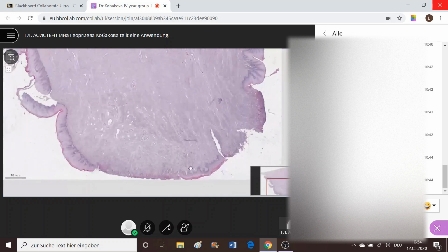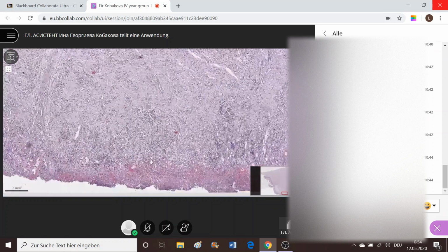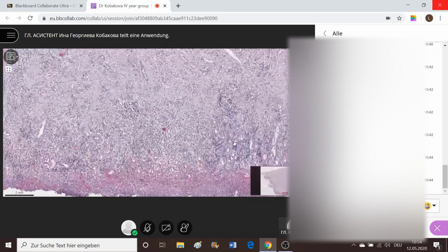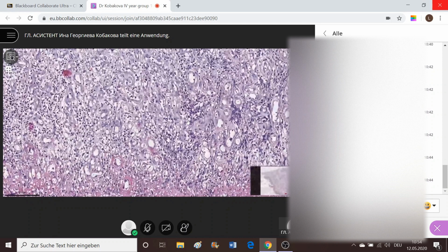And since it's desquamated, missing, and it's proceeding with mixture of necrosis, acute and chronic inflammatory infiltrate, both together in the form of granulation tissue with lots of newly formed vessels, as you can see them here, lots of lymphocytes.